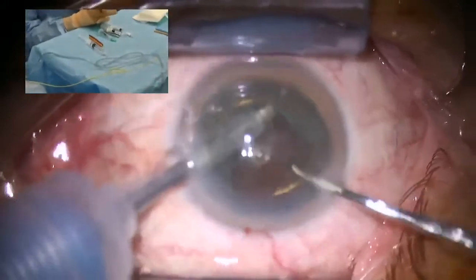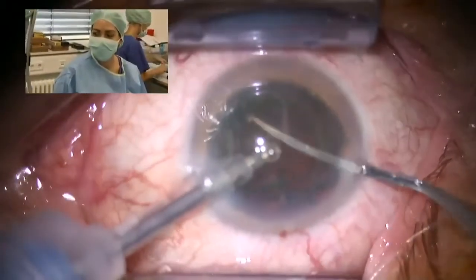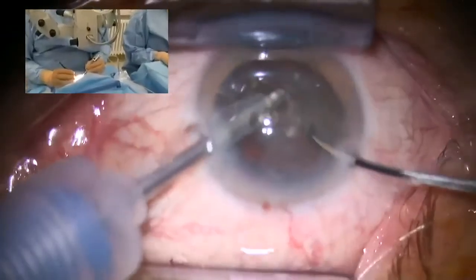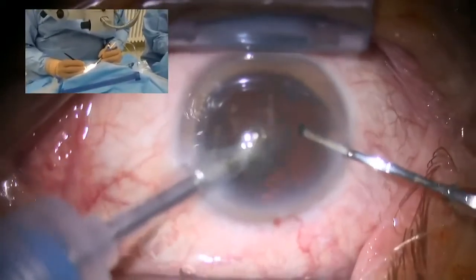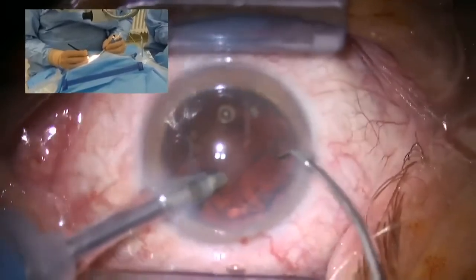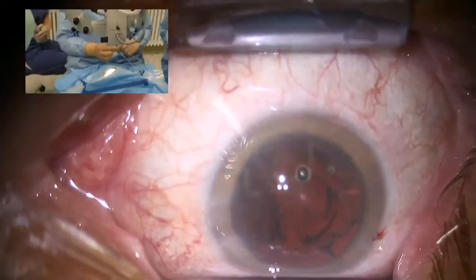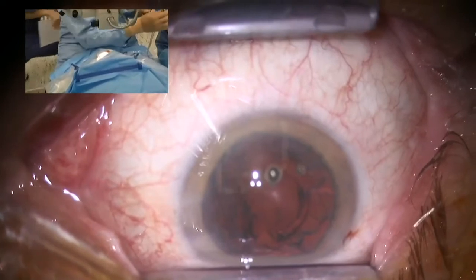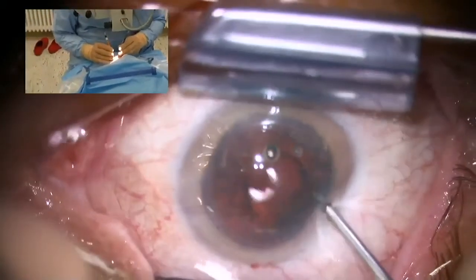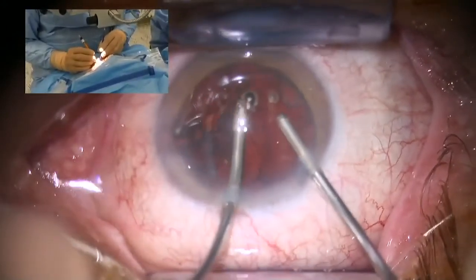The side port of the laser, the opening hole, is not rectangular and not parallel to the axis of the tube, but it's angled so that it's very easy to reach nearly every point inside the capsular bag, and this makes the whole situation very safe, because the last thing I would like to do is a capsular rupture. Oh, it's a good thought maybe. If you have a capsular rupture with the nanolaser, you normally have a round hole inside the posterior capsule, and not a rupture. So it's normally easy to deal with this by enlarging the hole towards a posterior capsulorhexis.